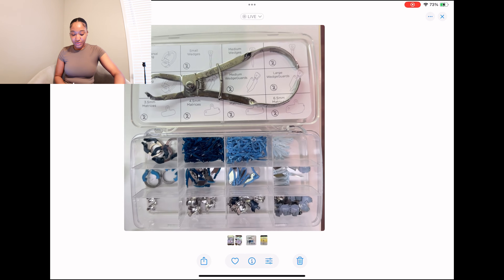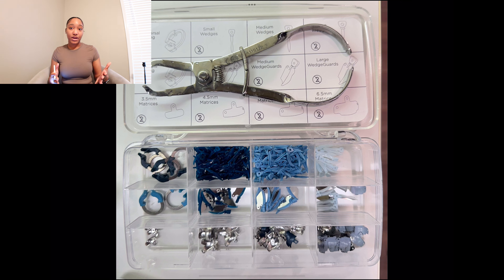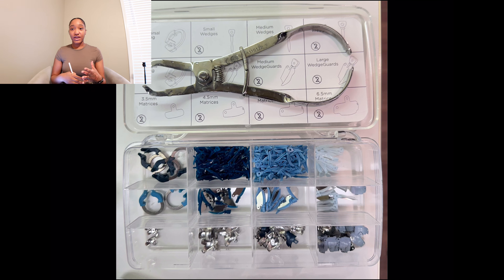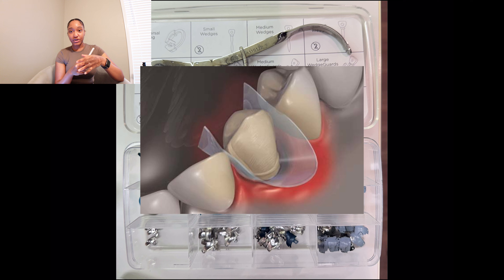In order to get areas like the mesial and distal and make the contacts perfect, that is where you're introduced to systems like the Garrison. What I'm showing you right now is the paladin kit. Some of you — your doctors may use the Tofflemire, which is the little metal tool that has the matrix band and the wooden wedge. I had to learn how to place that in dental assistant school. Another option is a mylar strip — that little clear strip used mostly for anteriors, placed in between to help with contact areas.